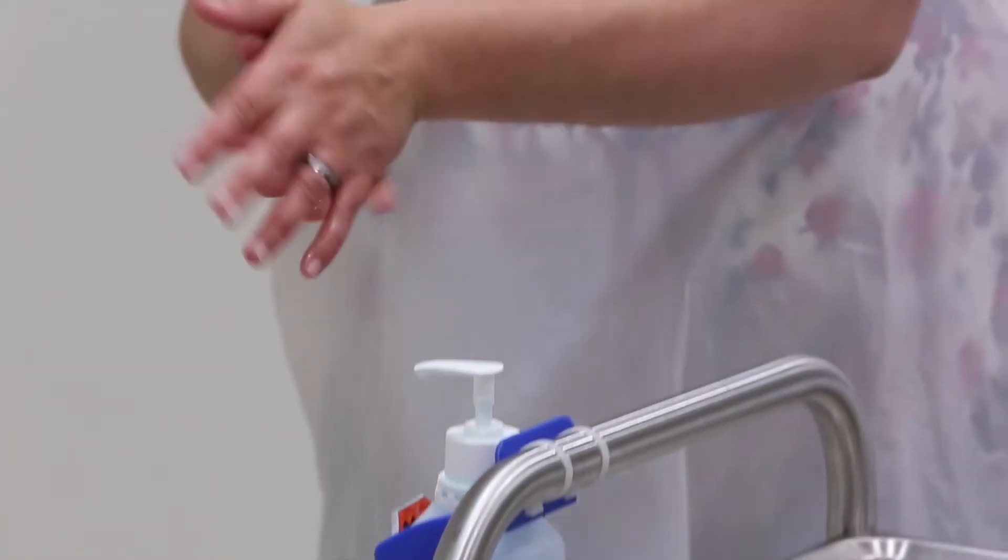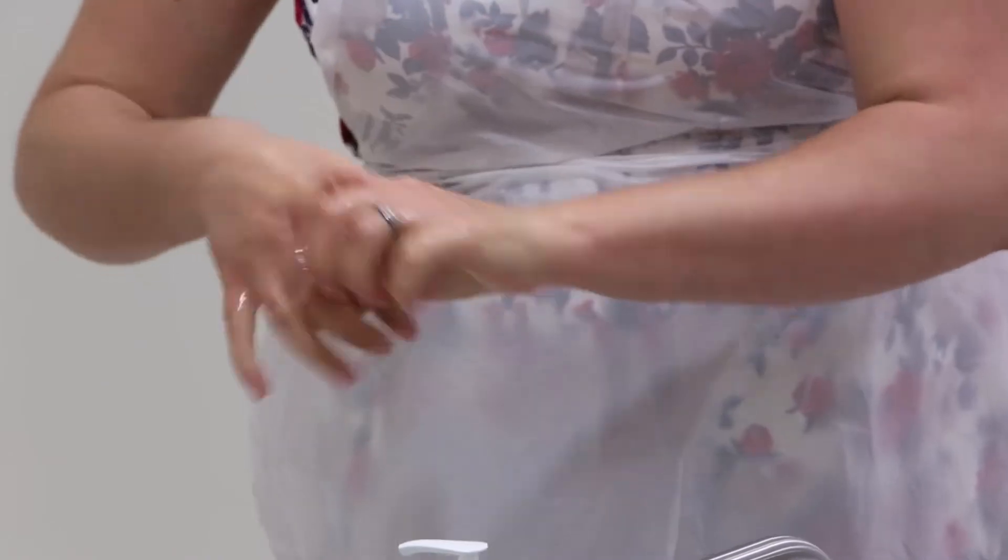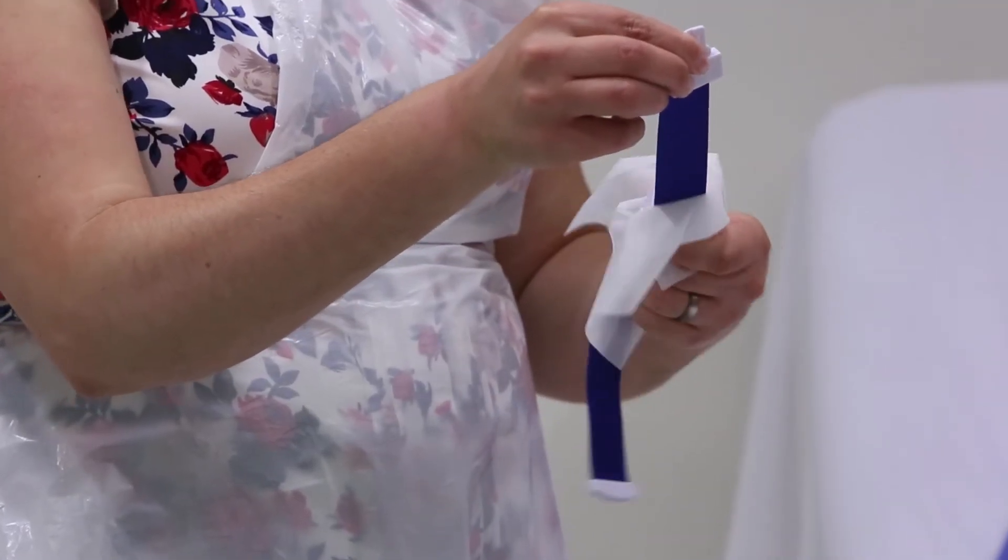Apply alcohol hand rub once again and allow your hands to dry. Using a clinical wipe, clean the tourniquet.